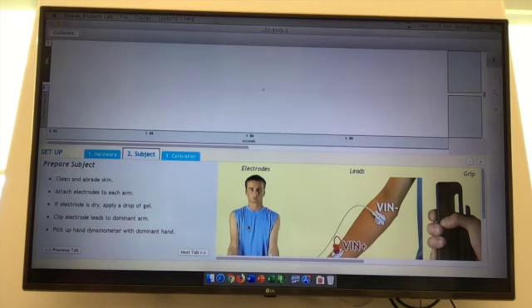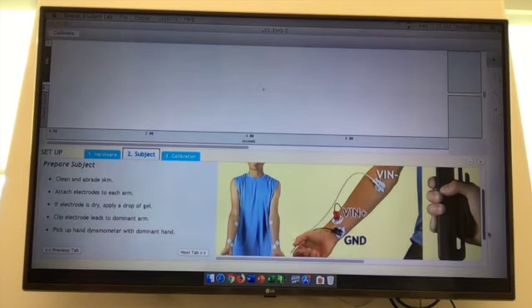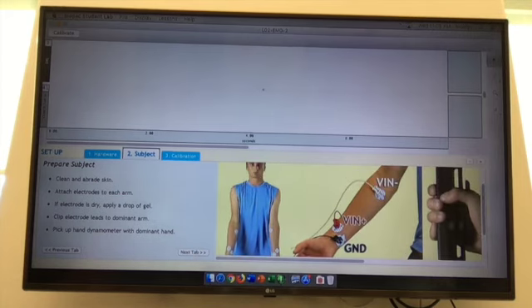We have our subject set up with 3 electrodes on their arm, and that is going to measure how strong their grip is as we go through this. It's going to be measuring the grip strength by measuring the electrical activity. Remember that muscles have to have nerves firing. We have these motor nerve endings, which you'll see in the lab today as well.